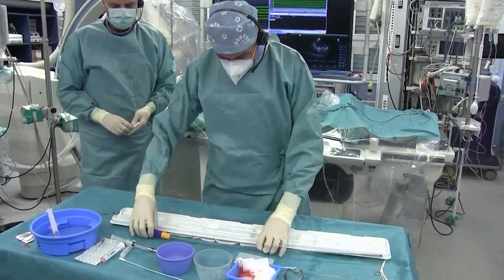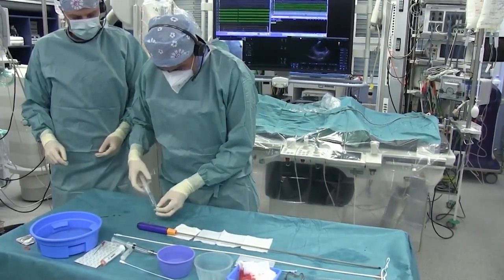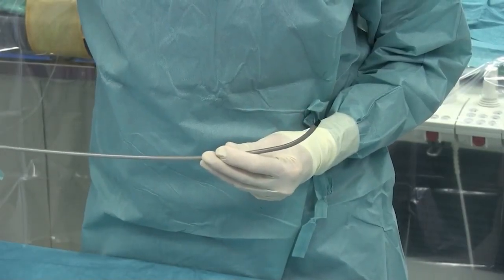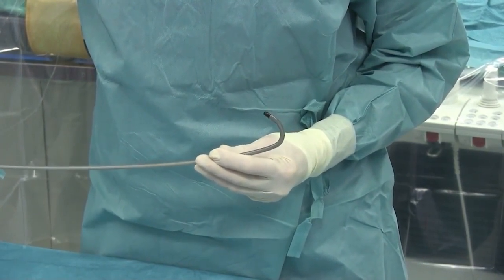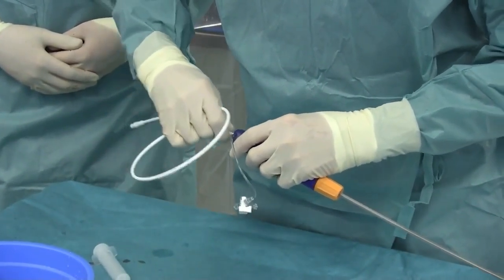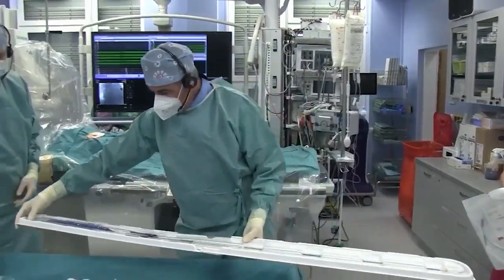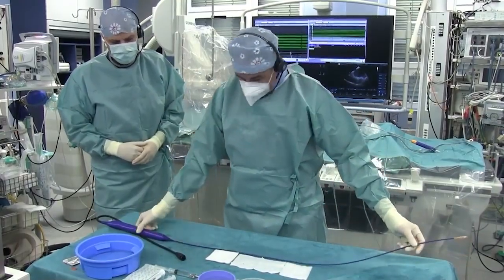Prior to insertion into the body, both sheath and dilator should be flushed with saline. The steering mechanism may be tested prior to dilator insertion. Moistening the dilator will facilitate its insertion into the sheath. Then the Farawave ablation catheter is unpacked and prepared. Availability of a long tray table is an advantage for flushing the catheter.